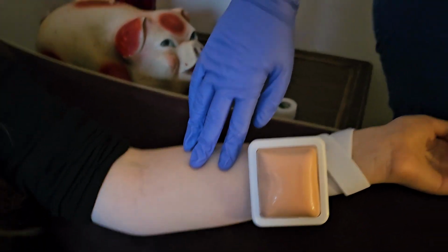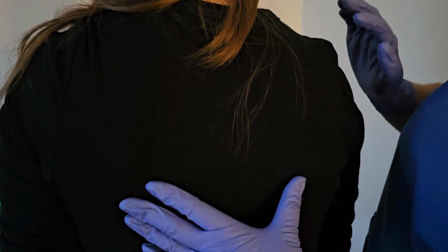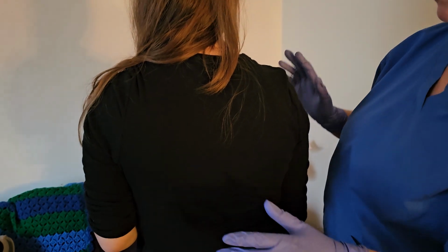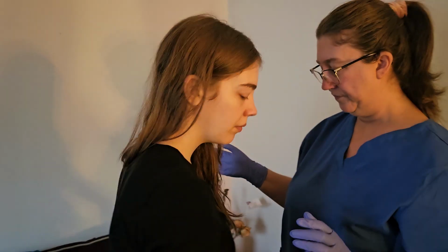You want a location where it's not hairy and there's no rash or anything like that. So this is one location. The other location is the upper back, just under the scapula. Okay. Go ahead, sit down.